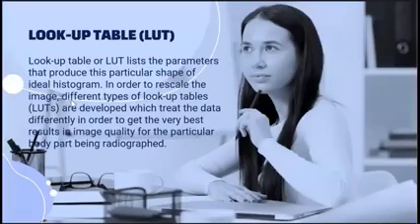In order to rescale the image, the different types of lookup tables are developed which treat the data differently in order to get the very best results in image quality for the particular body part being radiographed. So there are different types of lookup tables na installed in the computer. So there are lookup tables that increase or accentuate. When you see accentuate, it prioritizes the image of the bone. This lookup table will prioritize the image of soft tissues. This one will image the air-filled lungs. Okay, there are a lot of lookup tables.